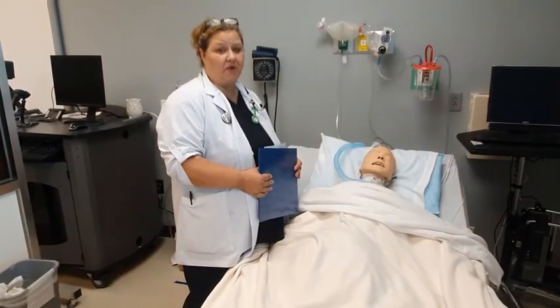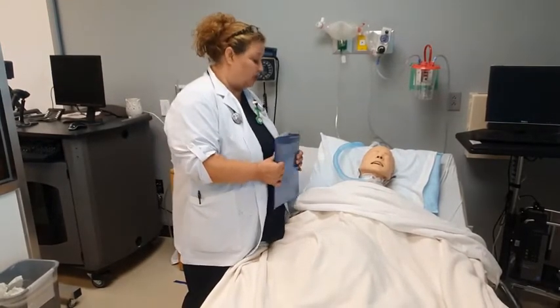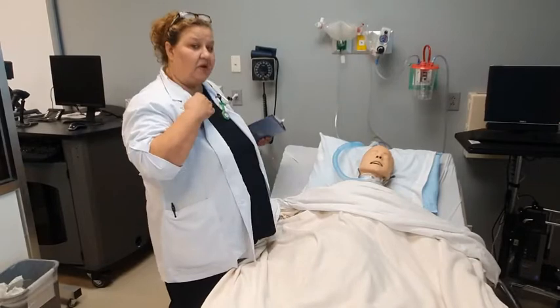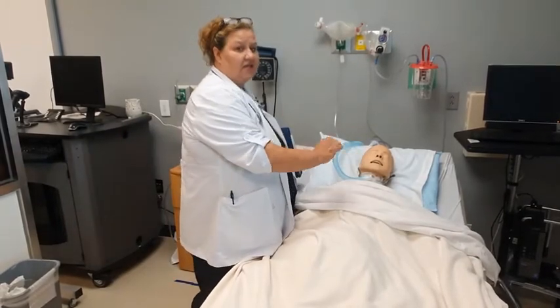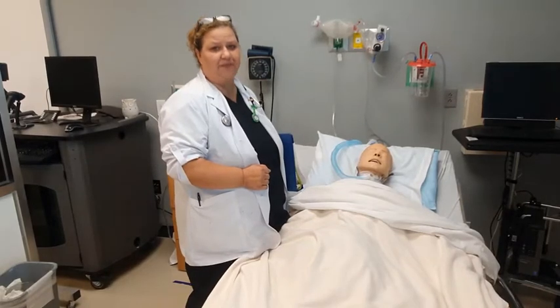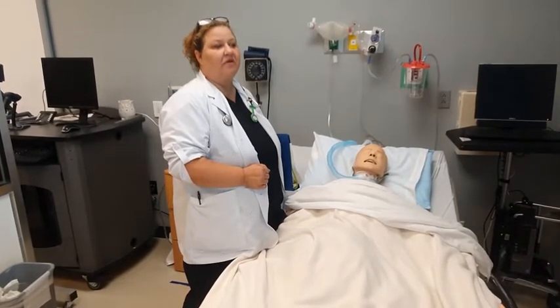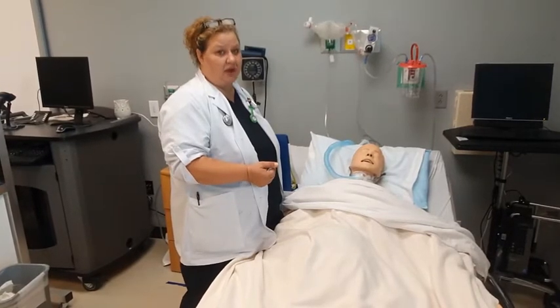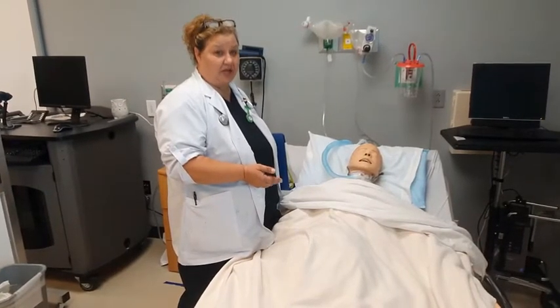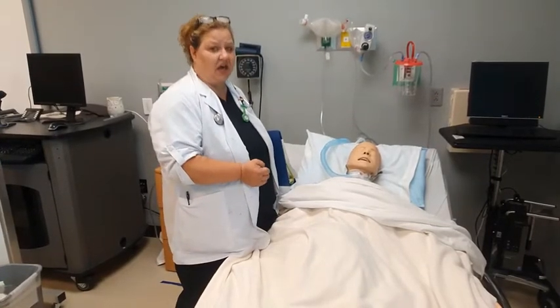Before you leave to get your supplies, you would take your stethoscope and listen to the lungs and the respiratory rate, and you would have that to document later. State that the client should be suctioned prior to trach care. So you would also make sure before you do the trach care that the patient does not need to be suctioned, and you would verbalize that during the checkoff.